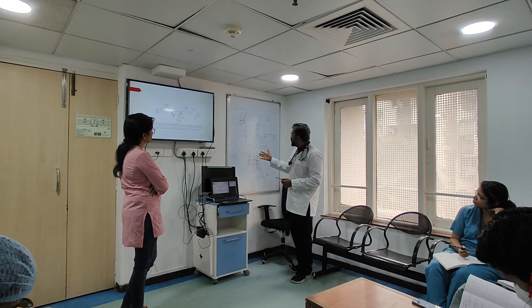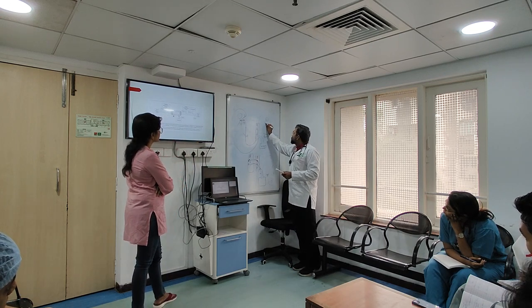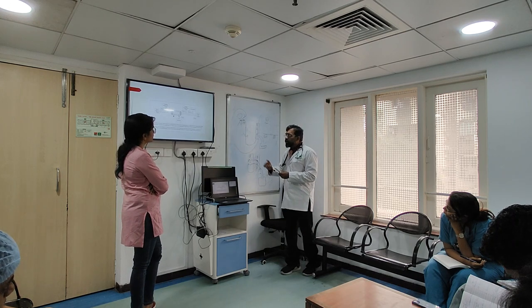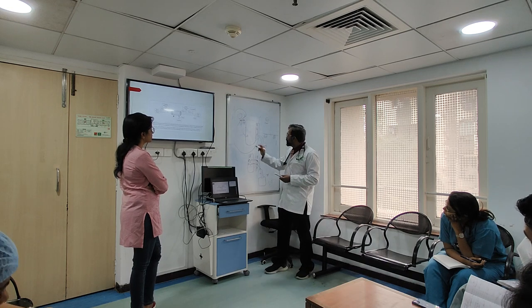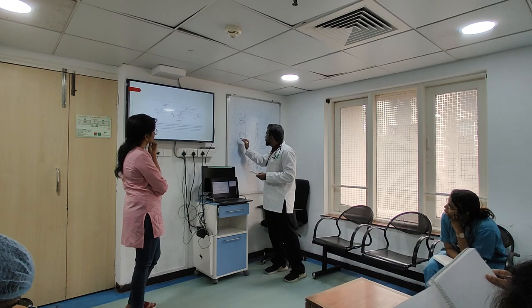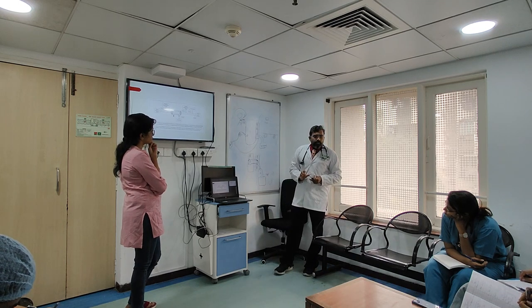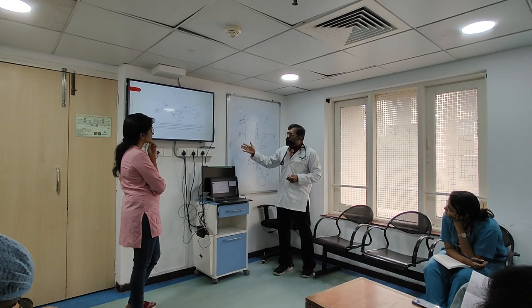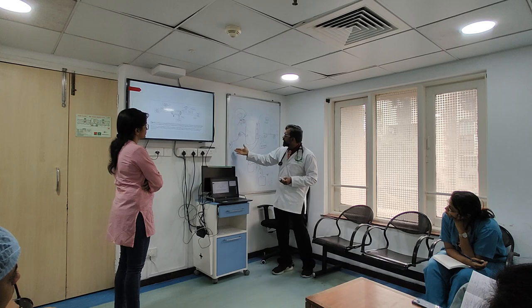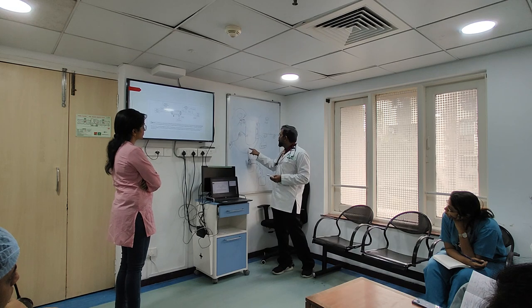So in CVVH, where do I place it? Here or here? Here. Okay, so let's place CVVH here. So in CVVH, what will I have to add here? I just have to add a replacement fluid. So if I add a replacement fluid here, I'll add another pump here, from a bag that is basically coming from the replacement fluid. I'm just adding one pump. Whenever I add one more pump, there will be more pressures coming from those particular areas. So I have put one pump in between for the replacement fluid. So this is one more pump. So replacement fluid going pre-filter in this case.